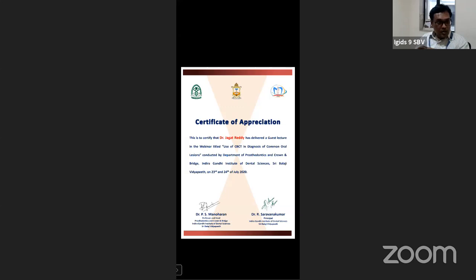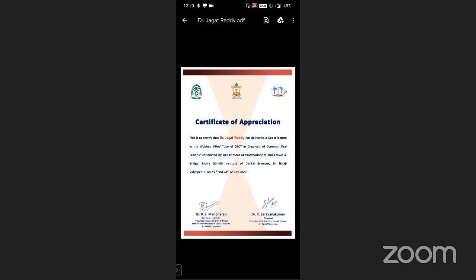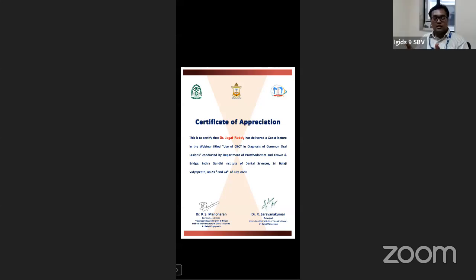Okay, Nishant asks, are axial, sagittal and coronal the same? See, basically they are planes. Plane or axis, it means a particular side. You should understand that axial, sagittal, and coronal planes are also called orthogonal planes. When you open up a CBCT software, you see a window called orthogonal plane. Orthogonal simply means straight. Ortho means straight. So yes, basically they are three planes. Whether you say planes or axis, it's to your convenience, but always please stick to the axis.